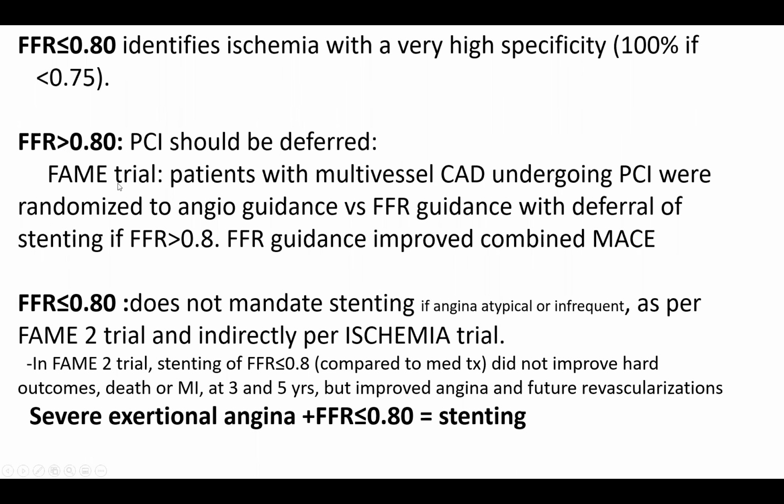And this has been shown in multiple studies, such as the DEFER trial and, most importantly, the FAME trial, in which patients were randomized to angiographic guidance, regardless of FFR, versus FFR guidance for stenting, with deferral of stenting if FFR is over 0.8. FFR guidance improved the combined MACE compared to angiographic guidance. And that's what put FFR on the map, the FAME trial.